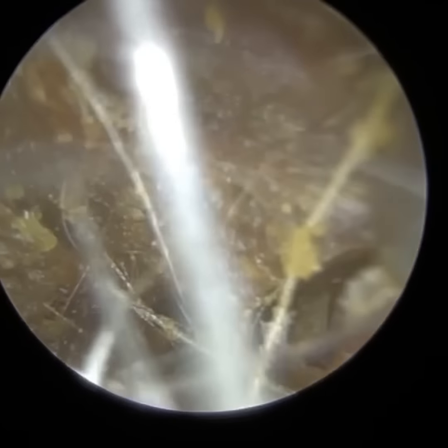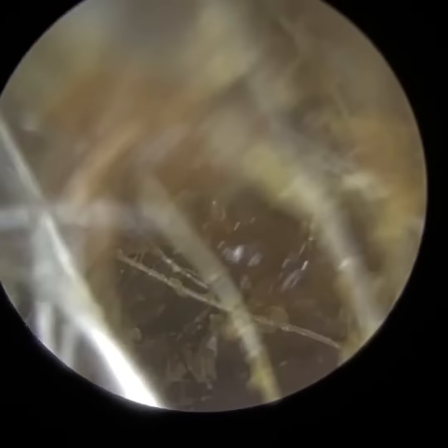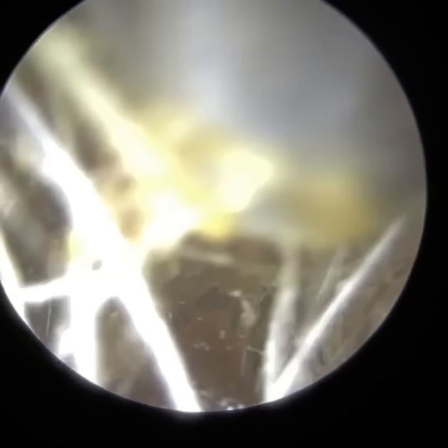Now, this patient originally attended about 10 months ago, and when they attended, they had a condition called mastoiditis, and they also had an active tympanic perforation, so a hole in the eardrum. Mastoiditis is an infection of the mastoid bone.